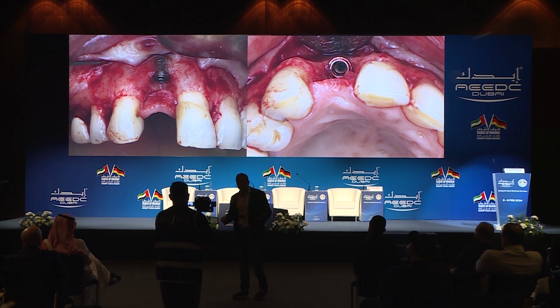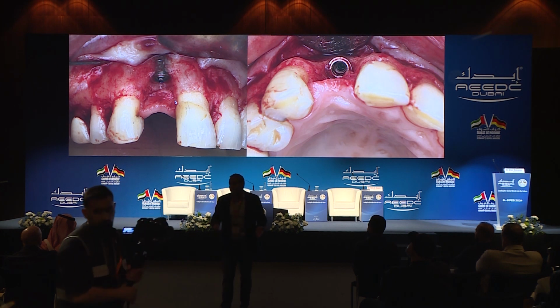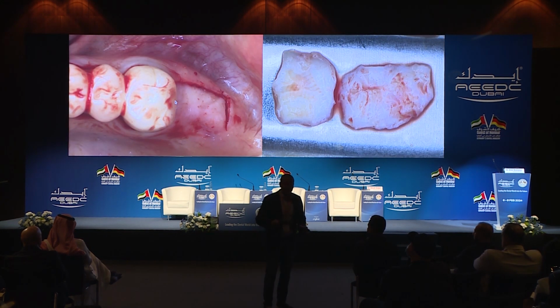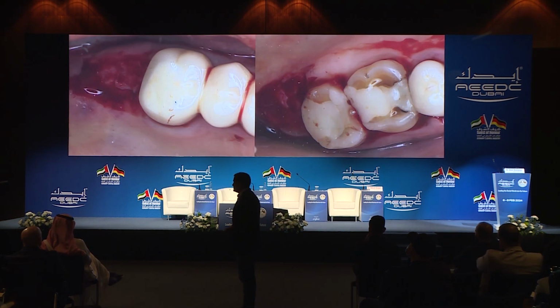There's no thin buccal bone, it's buccally placed and too deep. Maybe it's better to remove the whole implant and start all over again. But I decided, just for you, to try to save it so I can show you what will happen. So this is what we did. I took 2 tuberosities. She doesn't just have a gummy smile, but I'm lucky that she has 2 good tuberosities.